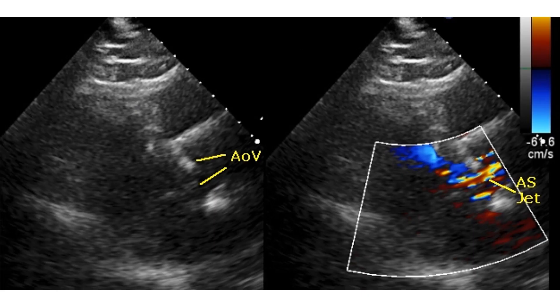This split-screen image is again from the parasternal long axis view, with the left panel showing the two-dimensional image and the right panel showing colour flow mapping overlay in the colour Doppler sector. Being of high velocity and with significant turbulence, it is seen as a mosaic jet. The width of the jet in the right panel fairly matches the leaflet separation in the left panel.